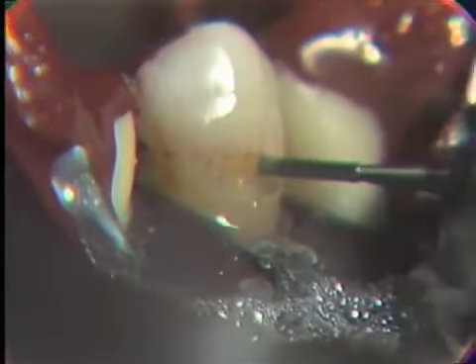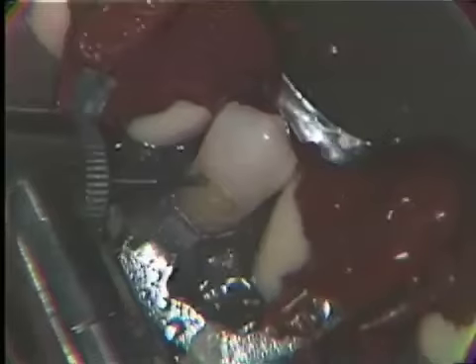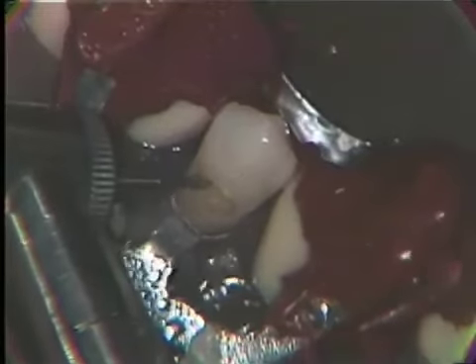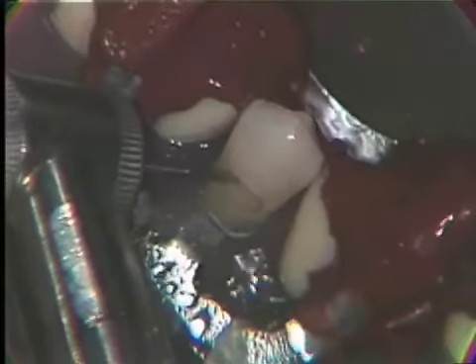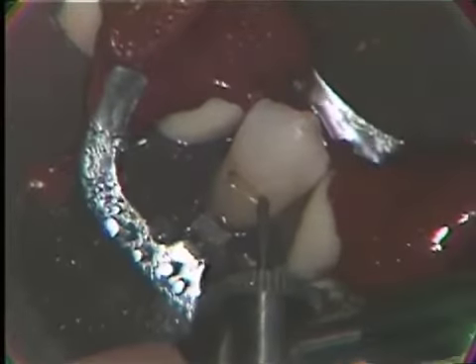You cannot leave pitted, stained, or decalcified enamel. For if you do, you're inviting further recurrent decay and will not have a continuity of the amalgam restoration along its margins. All the time that I am cutting on these lateral surfaces, note that I am tipping this burr. The reason for this is to try to ensure curvature to the axial wall.